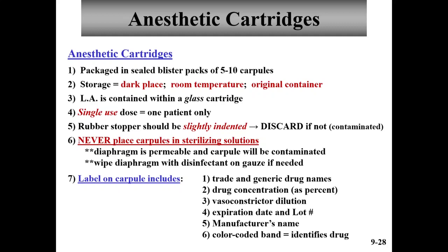You shouldn't use it. You have a rubber stopper end of the carpule, and on the other end is a diaphragm or a thin membrane. That membrane is permeable, and in fact that's where you're going to put the carpule penetrating end of the needle, through that membrane. But if you take the carpule and put it in a disinfecting solution, that solution is going to be absorbed into the cartridge and will become contaminated.